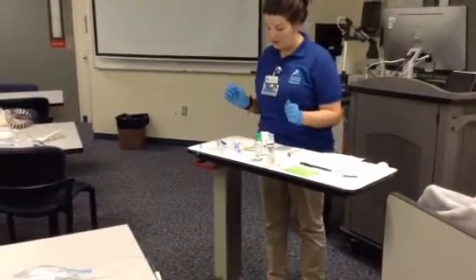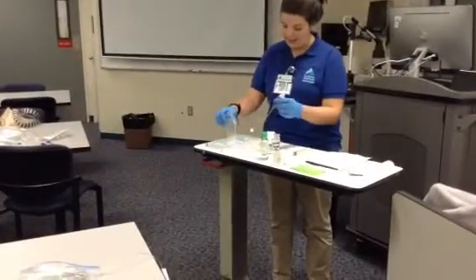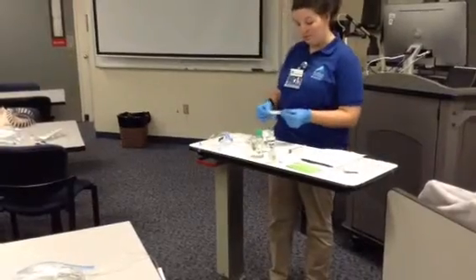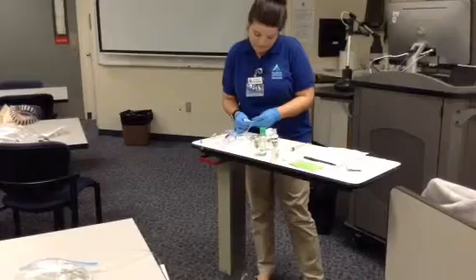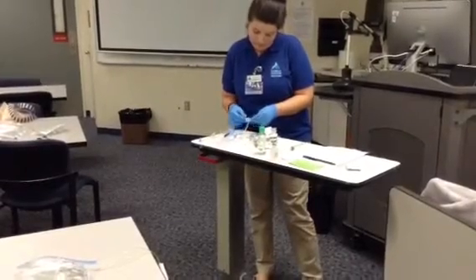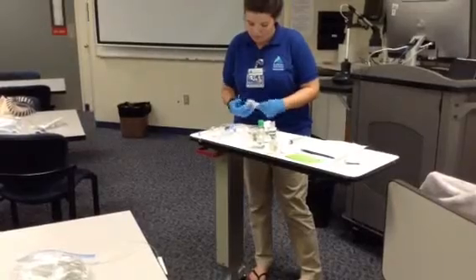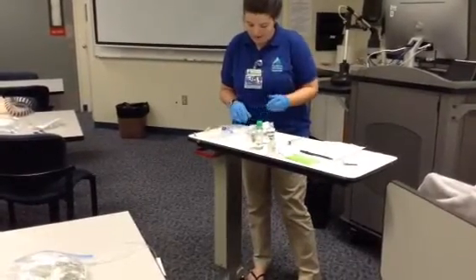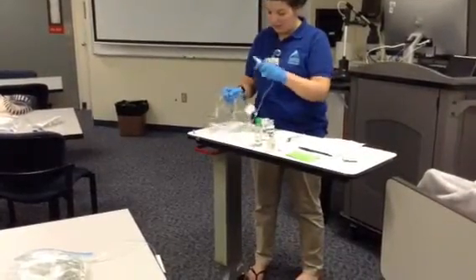Now on my tubing, I'm going to go ahead and connect it and put my label on my tubing, which has my date, time, and initials. Alrighty, so that's ready. Go ahead and connect my tubing.